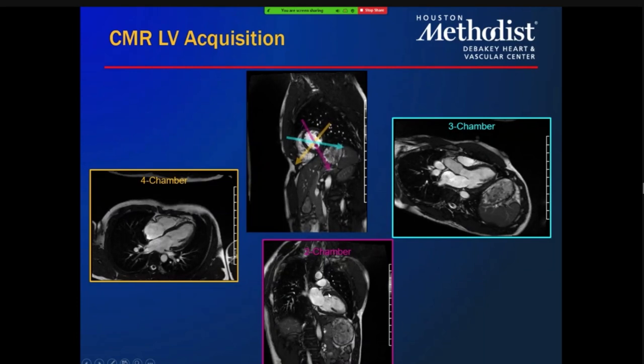And I do bring this up also because not long ago we had professor rounds, and I remember a fellow being asked to assess a four chamber view of the heart, and he commented the RV looks a little bit generous. The problem with this is that you can see we alter our plane to optimize getting the largest RV. So be careful when you assess the chamber sizes, because you want to know how your technique was done and what scan planes were chosen.